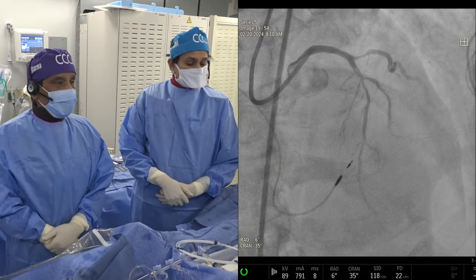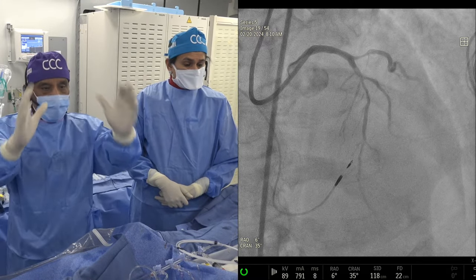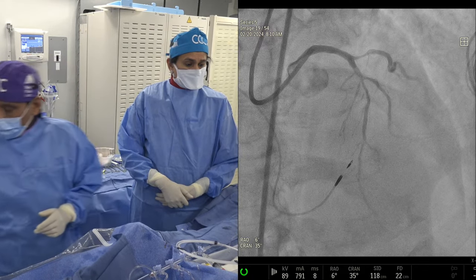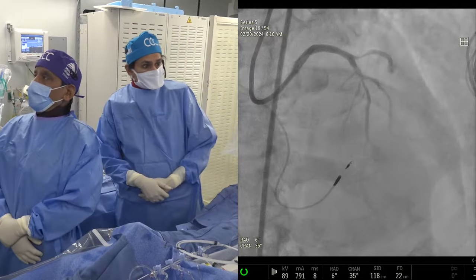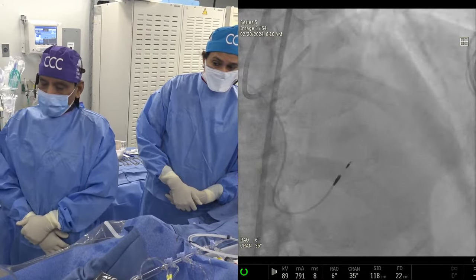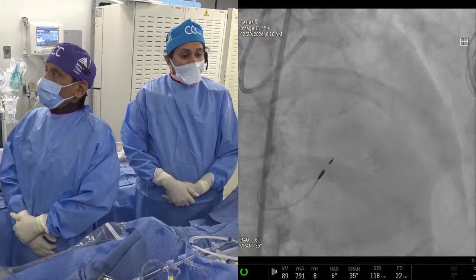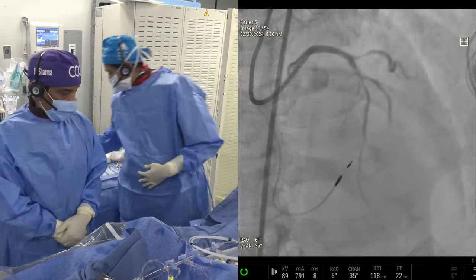Do we make the diagnosis based on the IVUS? Because that's what we have said. You have severe calcium, tram track, you don't need any imaging to make a diagnosis. But in this kind of a hazy area, like this case, is there a calcific arc of more than 270 degrees, or we give it a calcium score on the IVUS or OCT of 3 or 4, which means will require some strategy before you go ahead and just do the balloon and stenting.